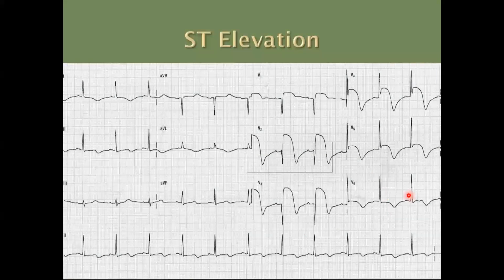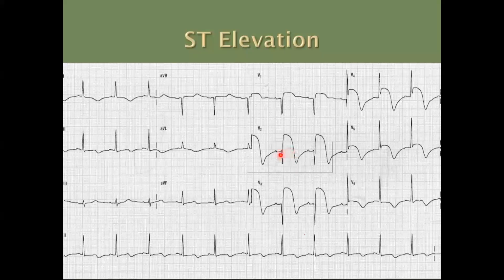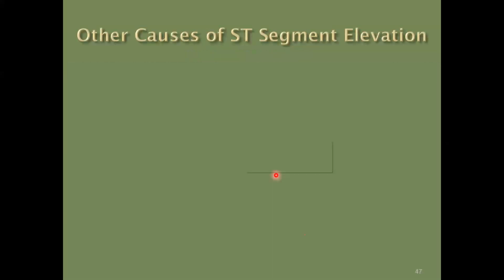So take a look at this one. And you can see here, you've got ST segment elevation here. Look at these ST segments. And this has progressed to the point where your T waves, which were initially probably hyperacute, have inverted here. But this is a really bad prognosis. And I always like to say RIP when you see those tombstones in there.